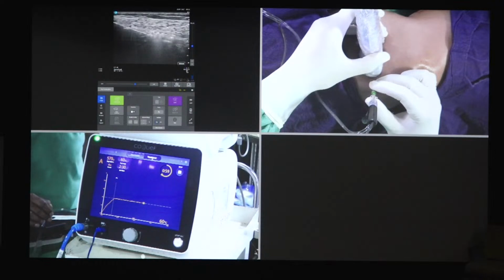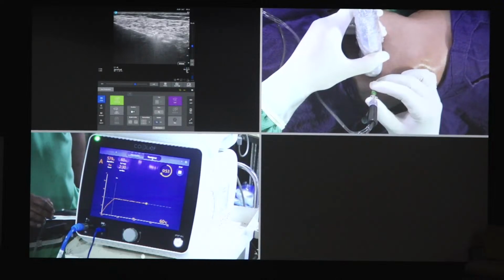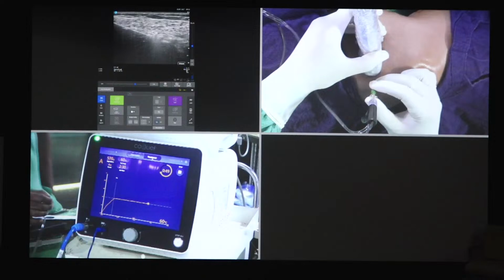So this is the medial branch of the nerve to vastus intermedius, and the superior-medial genicular nerve usually lies a little deeper. The important landmark for that is the adductor tubercle. It lies close to the adductor tubercle, just posterior to it. So that is the newer landmark, or the newer approach, to block the superior-medial genicular nerve.